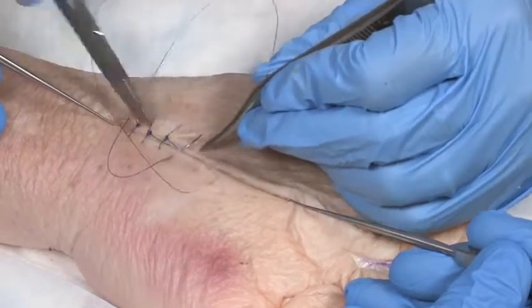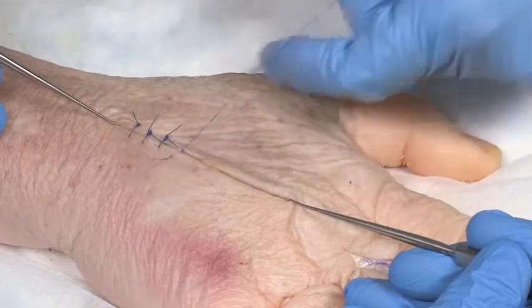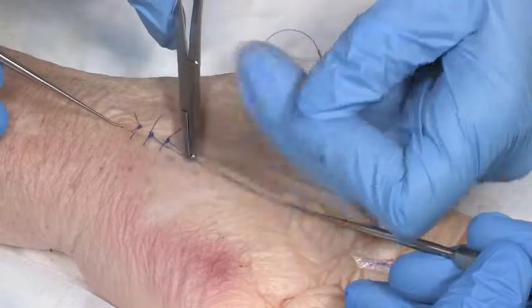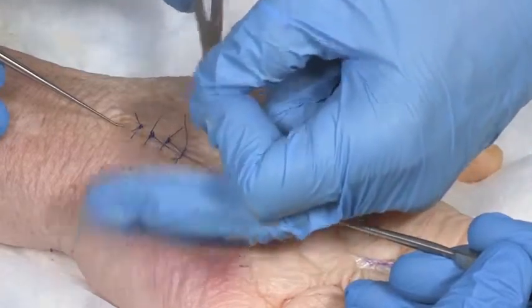Insert sutures along the entire wound. All sutures should be placed at the same distance from the wound edge and the same distance apart to ensure equal tension along the length of the wound.